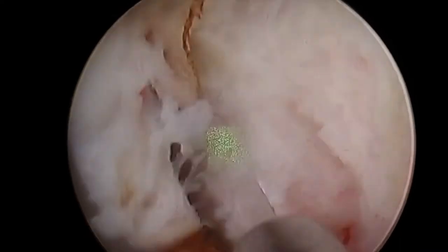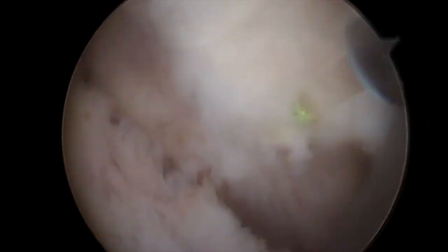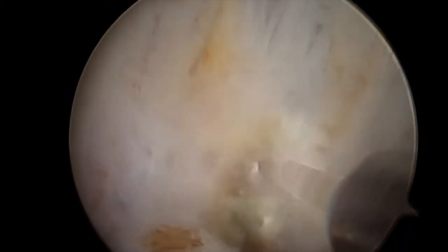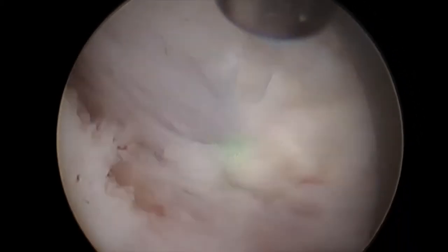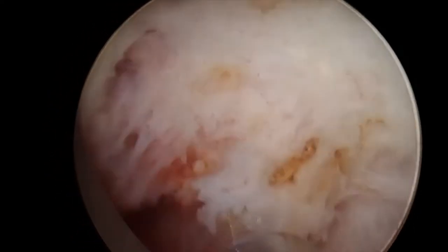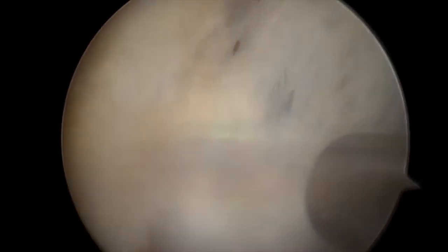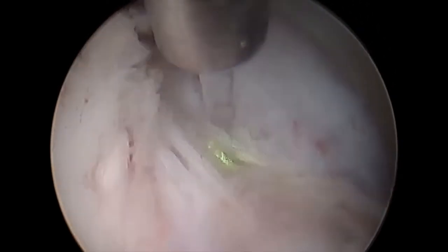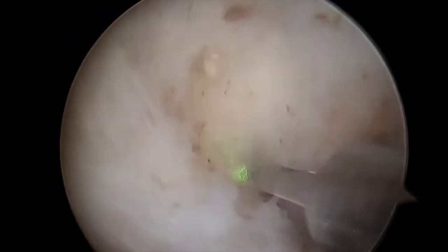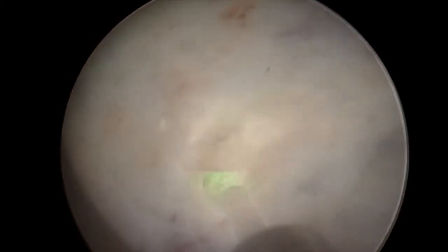Due to its properties and also the way of resection, the bleeding is minimal, as only the blood vessels that come through the capsule are transected, as opposed to other procedures which may transect numerous more blood vessels and have significantly greater volumes of blood loss and post-operative clotting returns to theatre for patients.